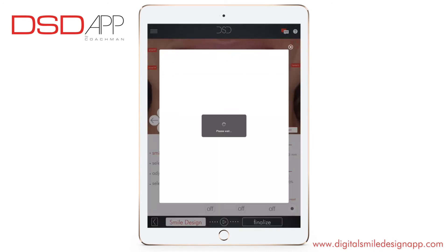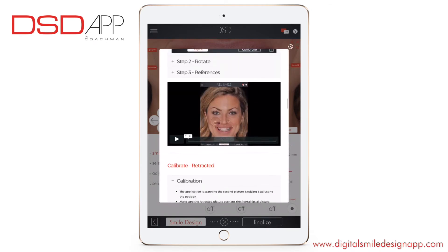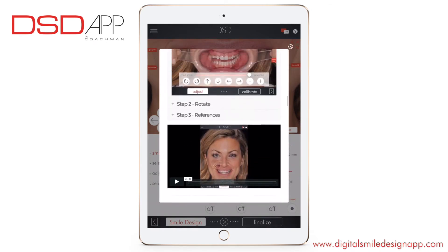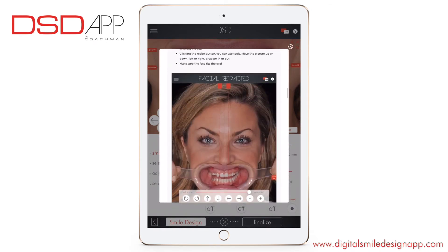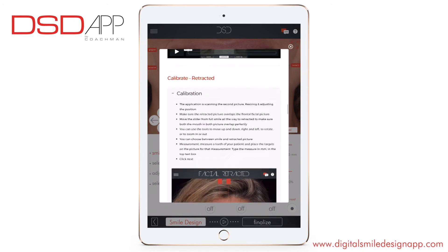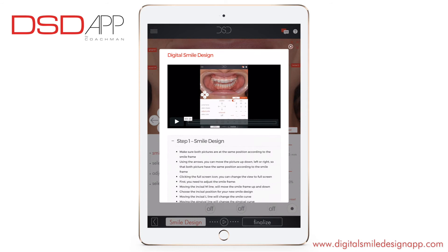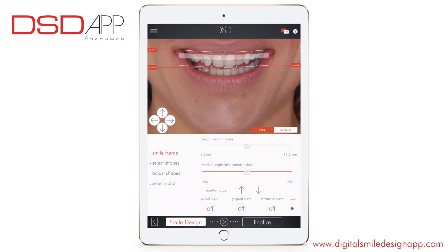Clicking on the help icon, you can watch video tutorials and the documentation about every single step — taking pictures, calibrate, smile design. First, we have to design the smile frame.